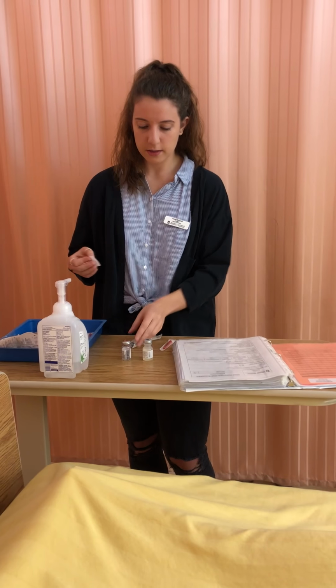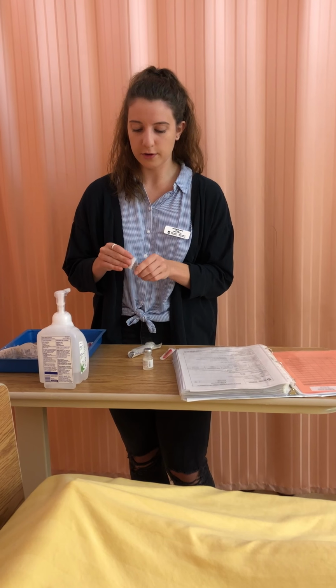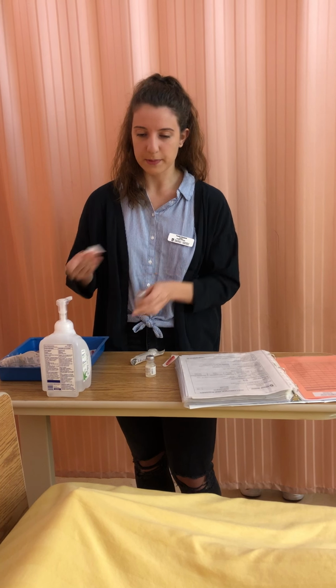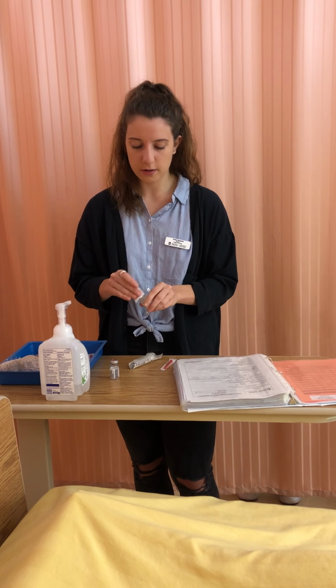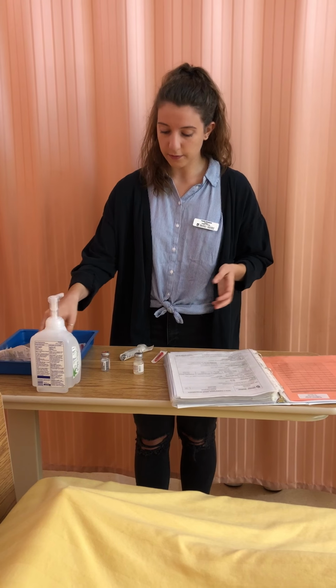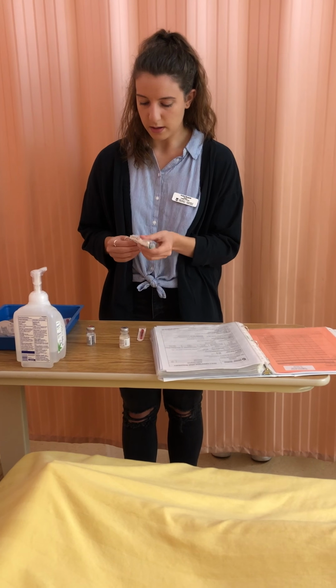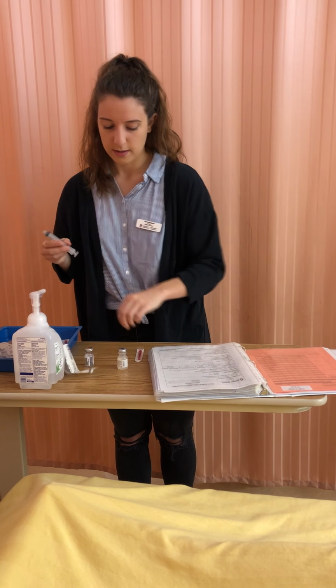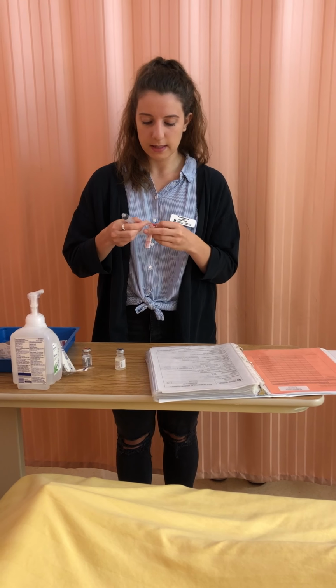So I have my vials here. I'm just going to swab them for 30 seconds and then dry for 15. So for the purpose of this video, 30 seconds is over, and 30 seconds is over, and then they're drying for 15. Using sterile technique, I will take out my syringe and attach my blunt filled needle.